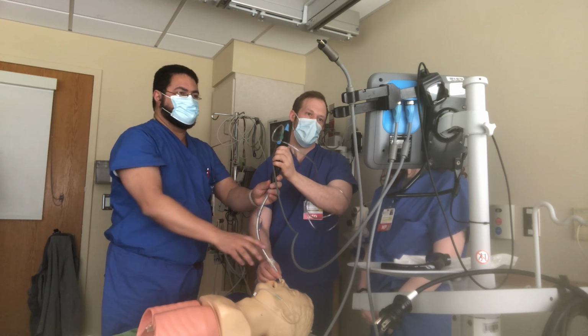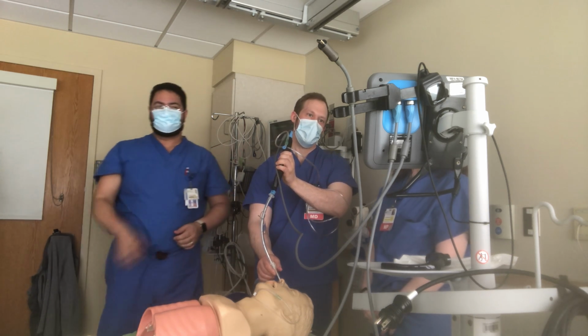Yeah. Push. You're in. You see the trachea rings? That means you're in. There you go, that part.